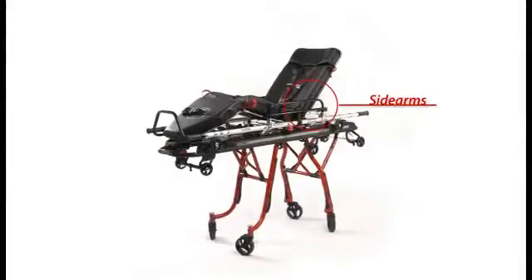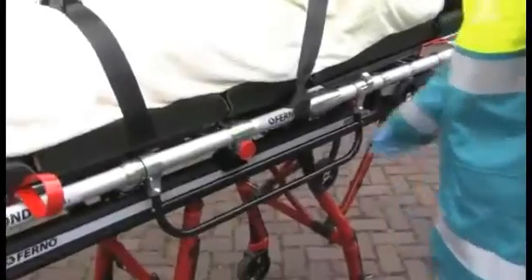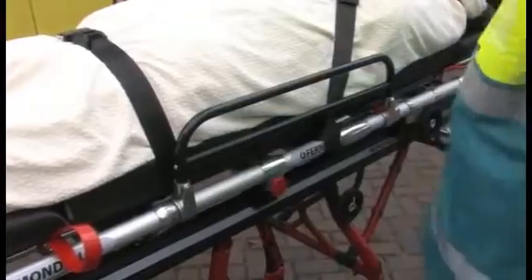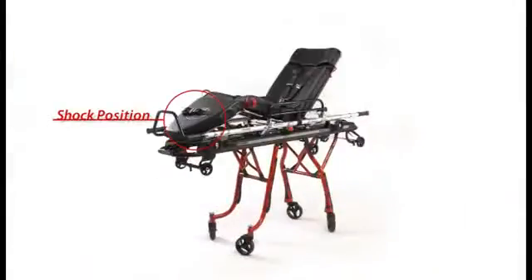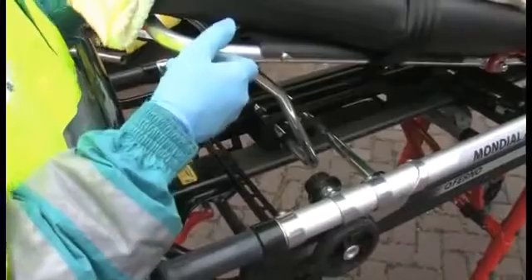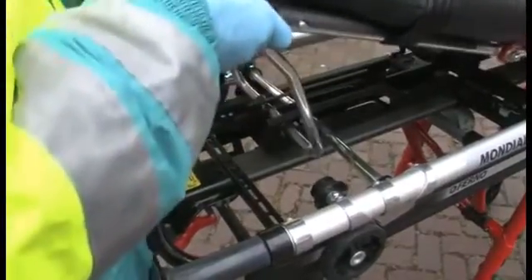To lower the side arms, pull out on the red knob and rotate the side arms down. To raise the side arms, lift up on the side arm until the red knob locks into place. When required by protocols, engage the shock position by lifting up on the end of the foot panel until it locks into place. To lower the foot panel, lift up slightly, press the foot end tabs, and lower the foot panel.